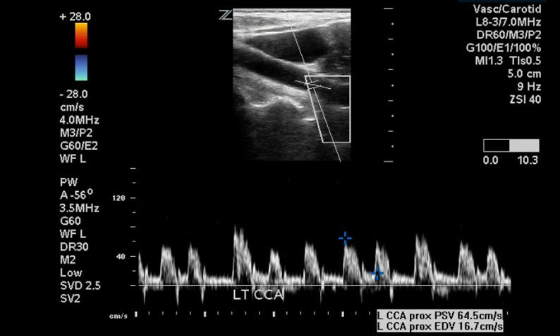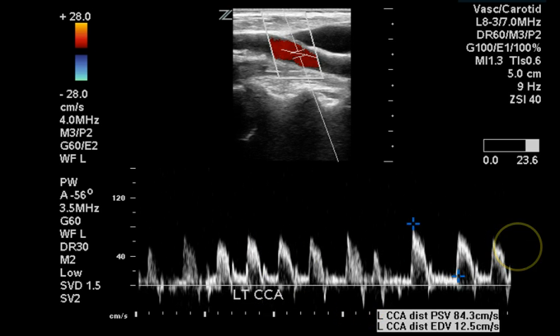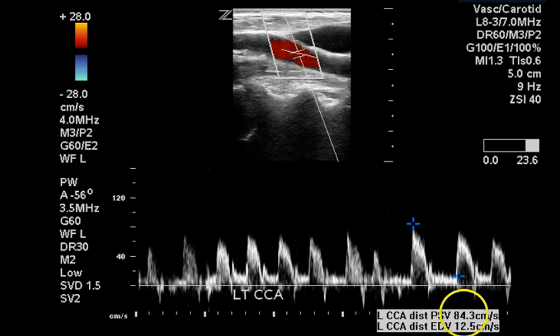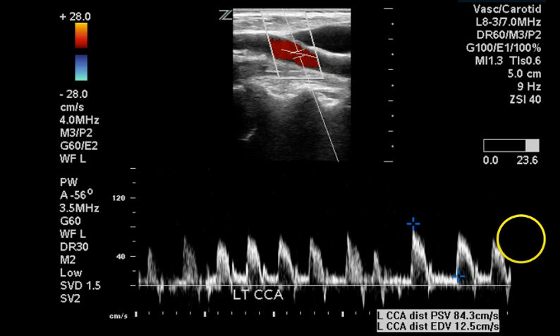The Doppler waveform of the proximal left common carotid artery appears normal with near-normal velocities. Again, an arrhythmia and a rapid heartbeat are noted. The distal common carotid artery also shows a normal waveform with a rapid heart rate.